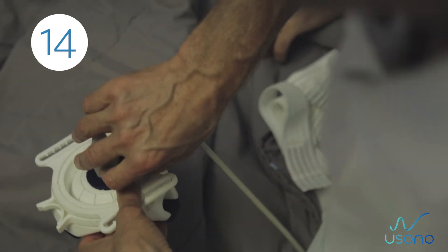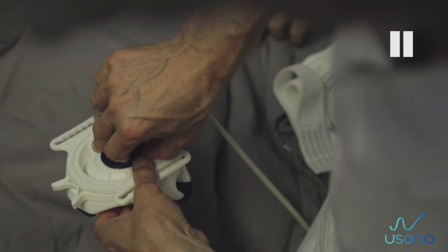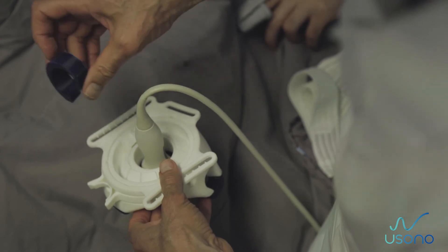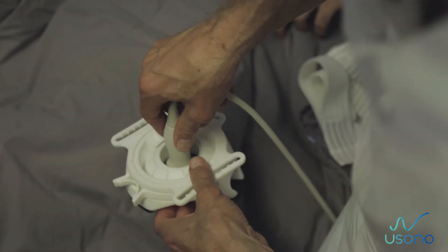Step 14: Grasp the lip on top of the silicon ring using two fingers. Pull out the lip until the silicon insert is completely removed. Take the probe out and proceed to clean the system.